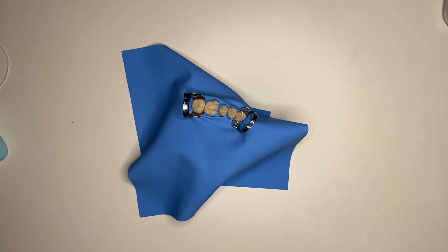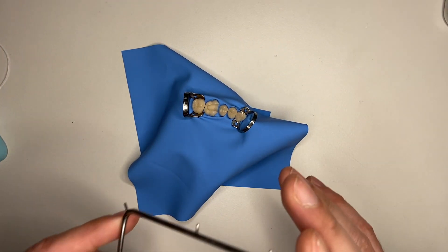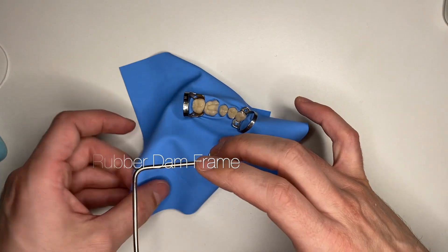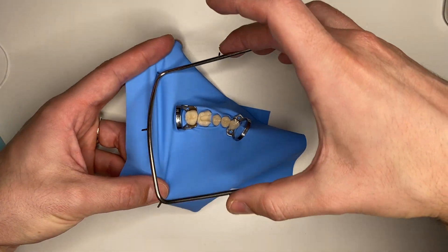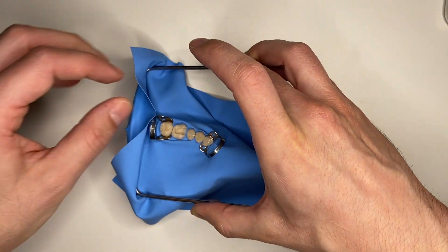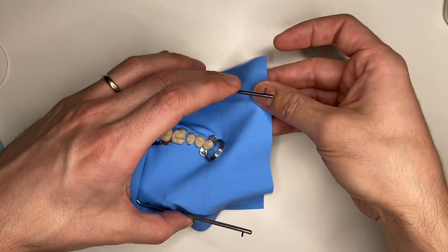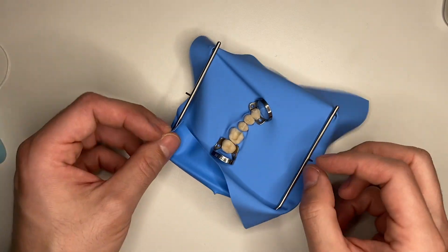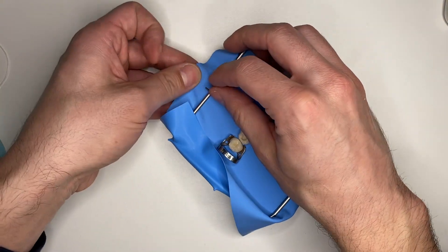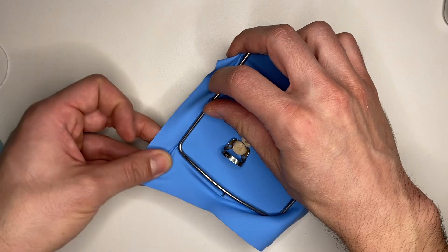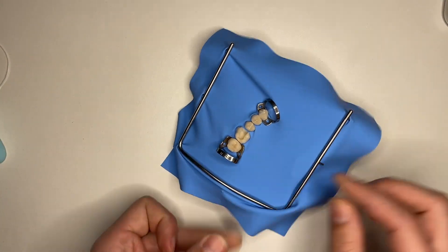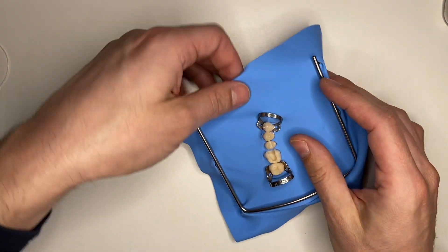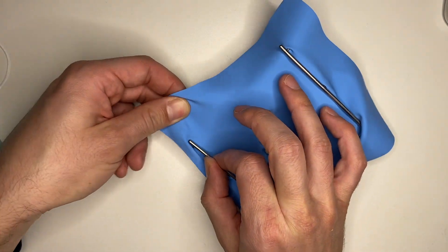Now you're going to be able to seat your rubber dam on this frame. You can first stretch it partially and then you can reseat it so that it allows you to have a nice straight rubber dam.